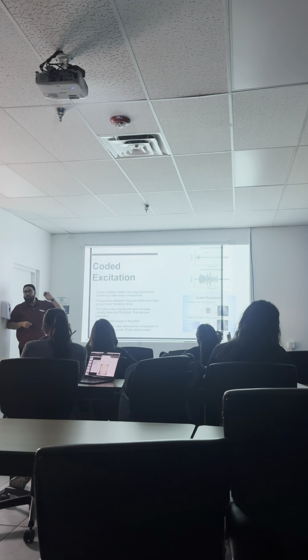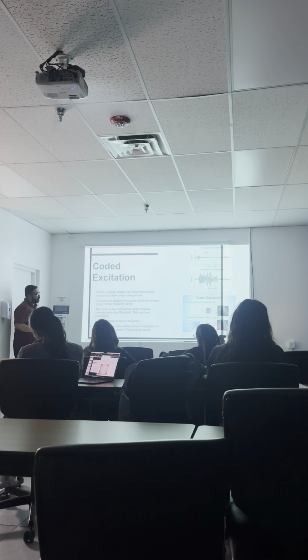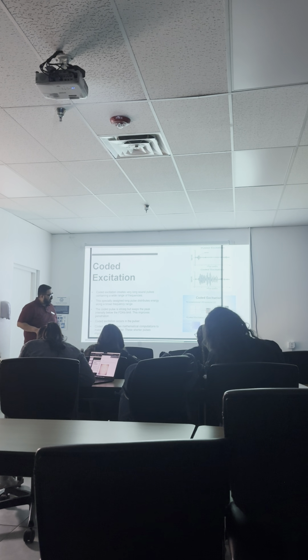Okay, so what modality would this benefit the most? Abdomen, right? Liver, spleen, kidneys. They're deeper, they're bigger organs, need more penetration to see the entire image. So if you guys can see the difference between image A and image B, which one is better? B, right? Why do you think it looks better?